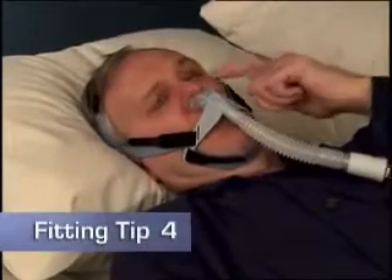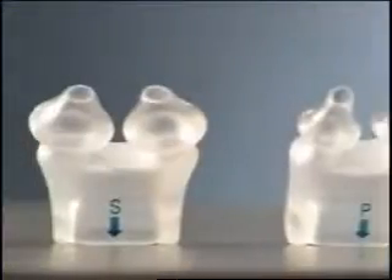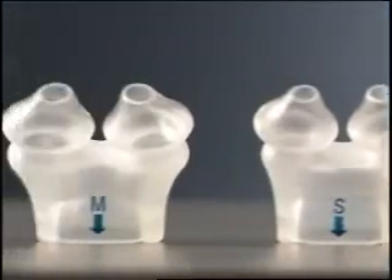If you can feel air escaping, there are several steps you can take to improve the seal of your cushion. Try a different size cushion for a better fit.